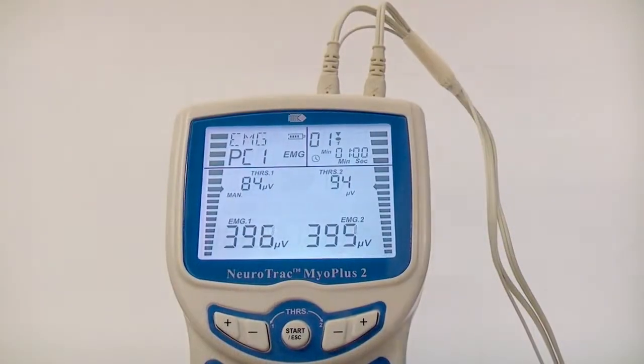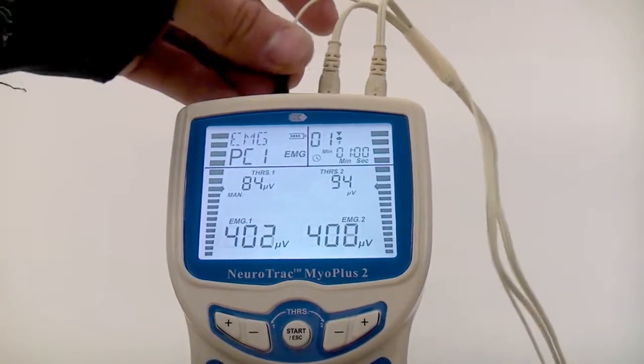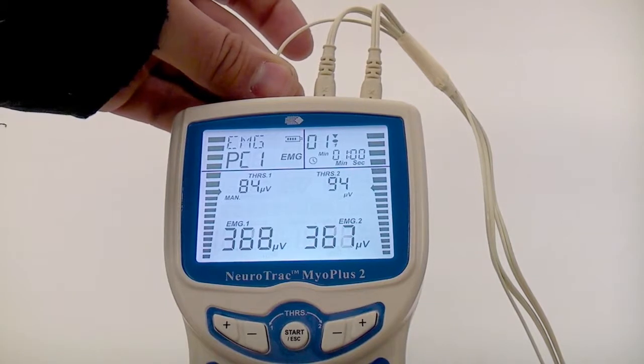There is one wire that is very important and should always be used with EMG. You don't have to use it if you're just doing stimulation, but if you monitor your EMG between stimulation periods or use EMG-triggered stimulation, you should always use this wire. This wire is called the reference wire and should always be used with EMG. Insert it into the MyoPlus2 near the reference symbol and place the electrode anywhere on your body. With old devices, the reference wire had to be placed on an elbow or near the bone. However, with the more advanced design of the MyoPlus units, the reference wire can go anywhere on the skin of the patient. See how the EMG drops when you use the reference wire.